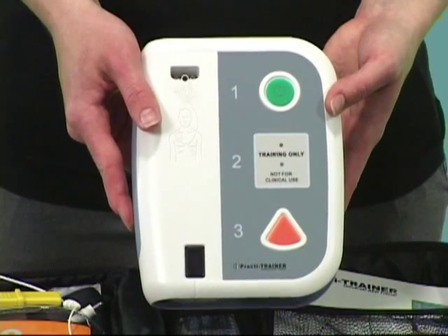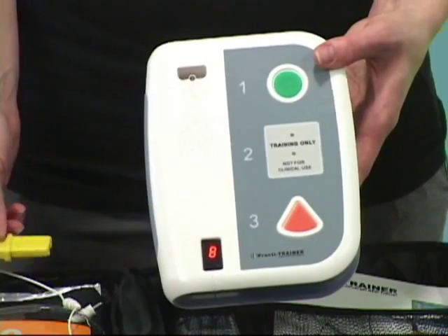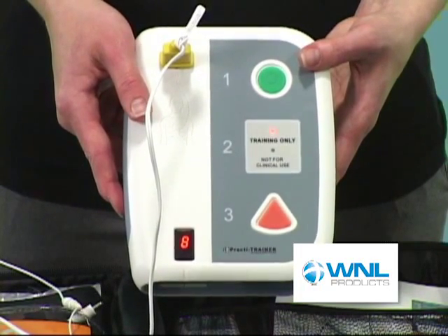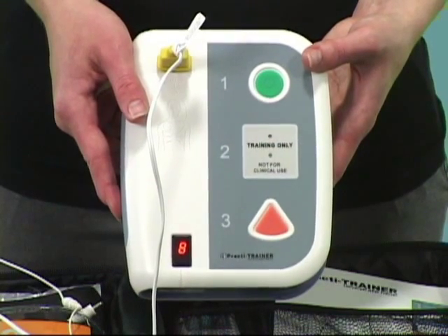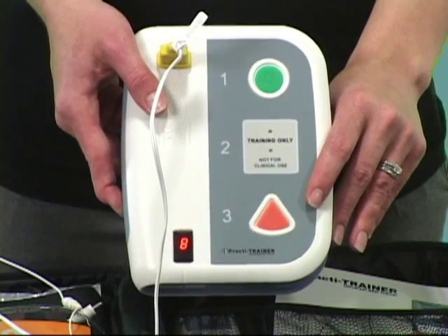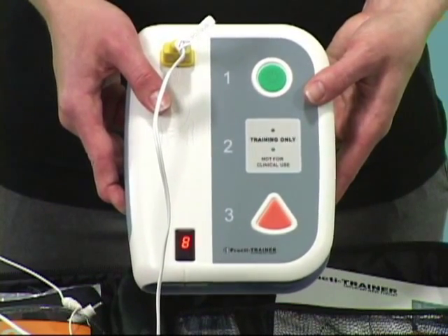Press the green button on the front and then just follow the prompts. Apply pads to patient's bare chest. Plug in pads connector. Analyzing heart rhythm. Do not touch the patient. Shock advised. Charging. Stay clear of patient. Deliver shock now. Press the orange button now. Shock delivered. Begin CPR.